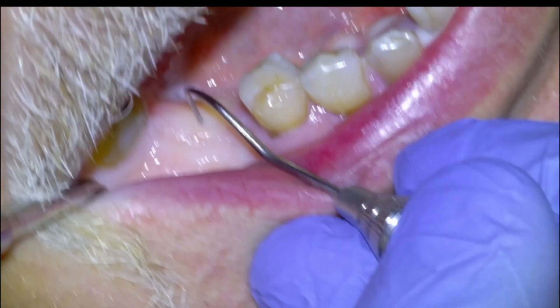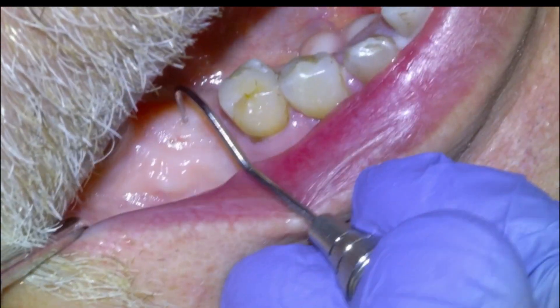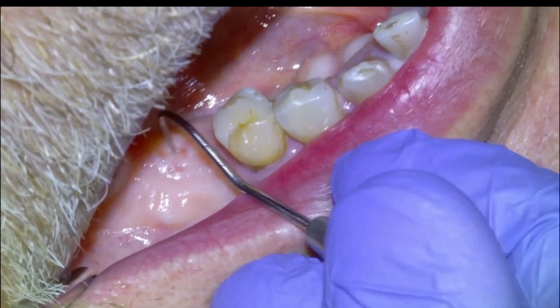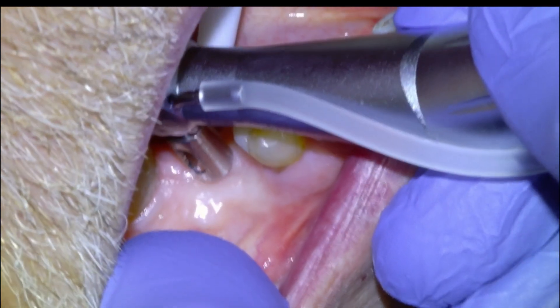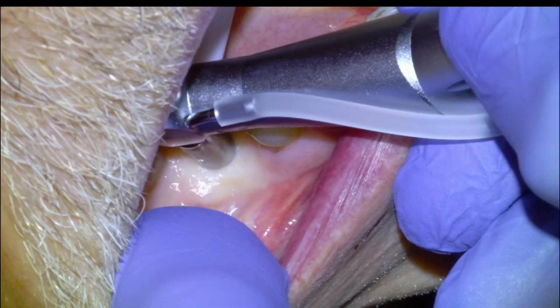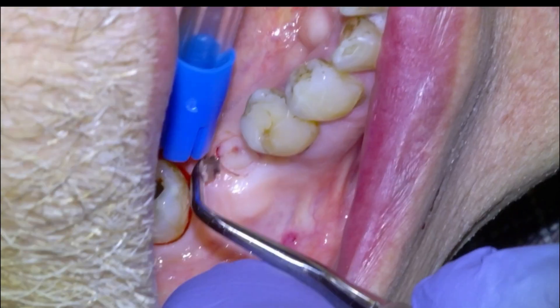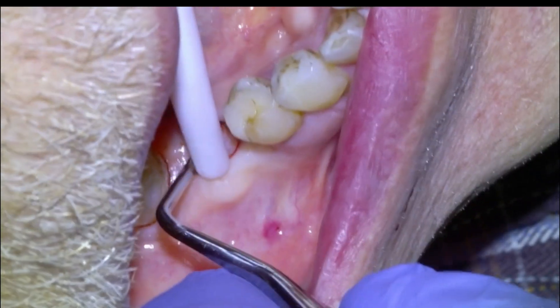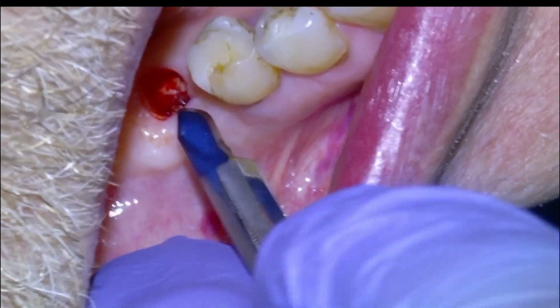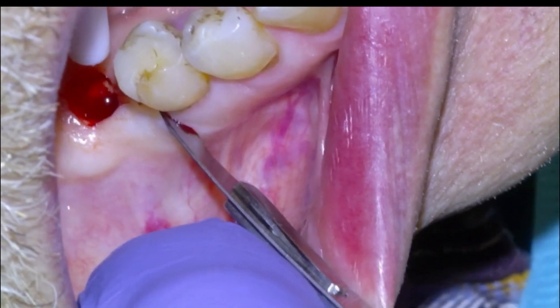Looking around the mouth, you can see there are no outstanding issues — gums are nice, pink, and healthy. We'll get started with the procedure. Sometimes I'll take a probe and poke right in the middle of the arch where we want the implant to come out of, to guide our tissue punch. I like to do a tissue punch and then a flap. We'll put a little mark with our explorer until we can see it clearly, then take the tissue punch, put it right over the mark, and press down firmly to sever the periosteum so we can scoop out the tissue. We'll lay a papilla-bearing flap mesially and distally and peel it back.